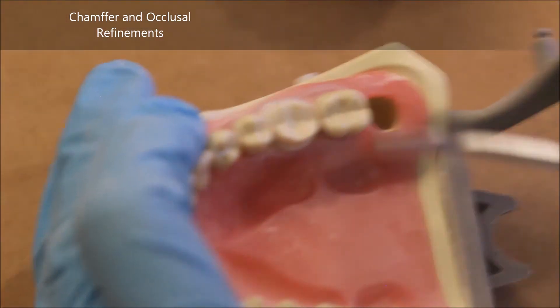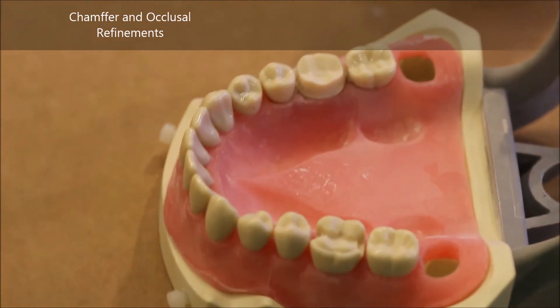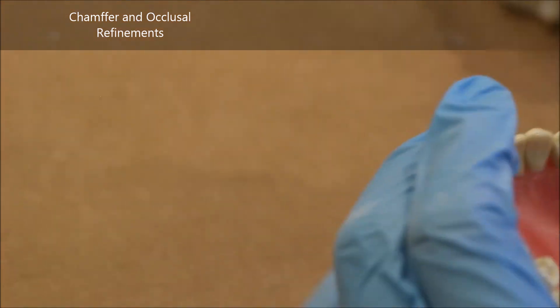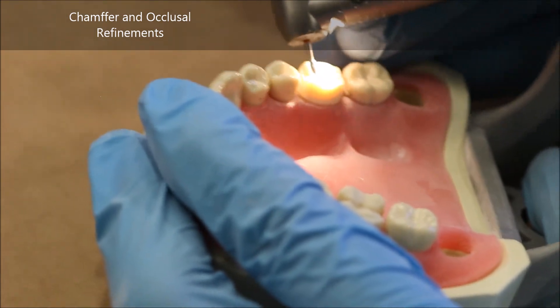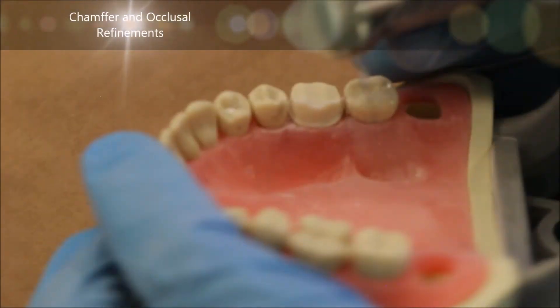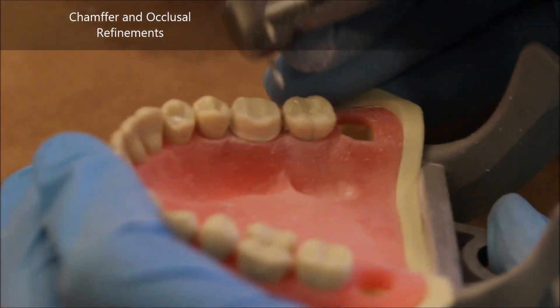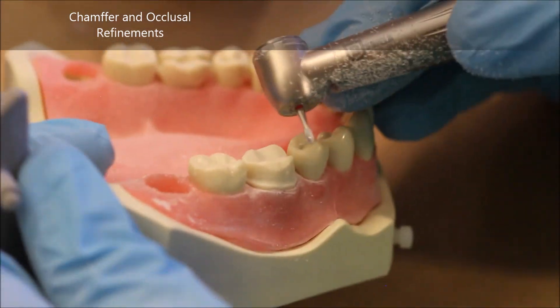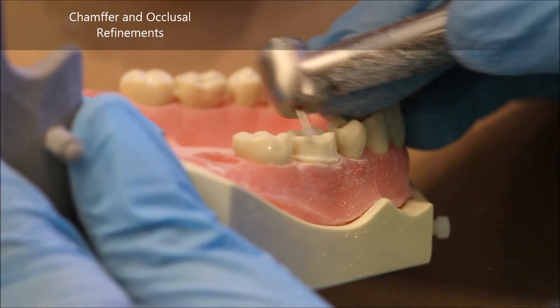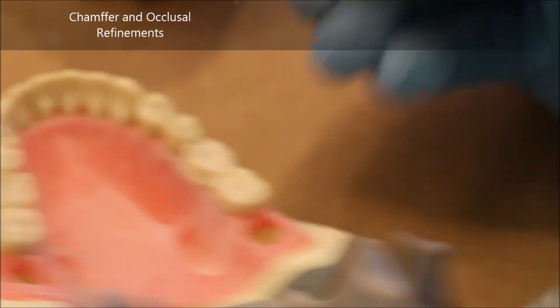Having gone once around the entire tooth with the 8877, I'm nearly completed with my prep. The only thing I want to do is ensure I take away any little cusp tips that are still sharp even after going over them with the 8877. The best burr for this is the 7404. It's also important now to place your non-functional cusp bevel, which is 0.2 to 0.3mm — just one quick smooth stroke around the cusp tips of the non-functional cusps, or the lingual cusps in this case.